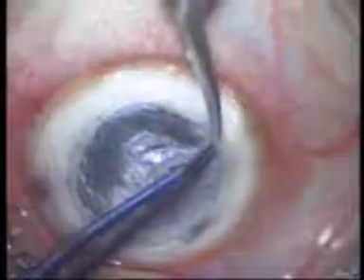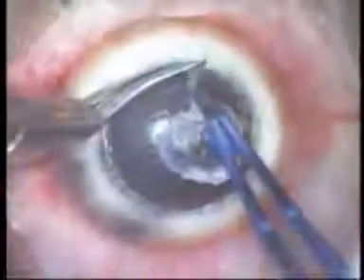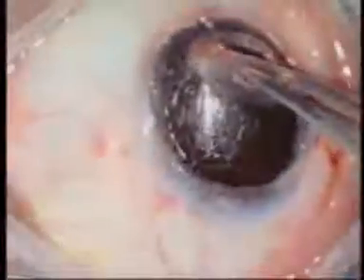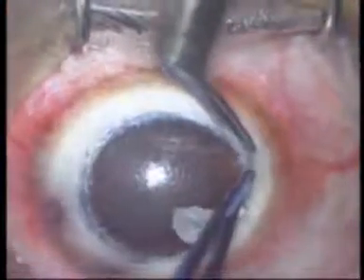In conclusion, the modified big bubble technique is an easy, reproducible, and inexpensive technique requiring no special instrumentation that can be used for selective replacement of corneal stroma. The technique has several advantages over penetrating keratoplasty and other techniques of deep lamellar keratoplasty, and should be the preferred surgical procedure for the management of stromal corneal disorders needing a transplant.